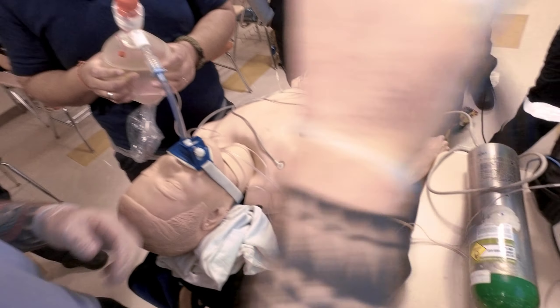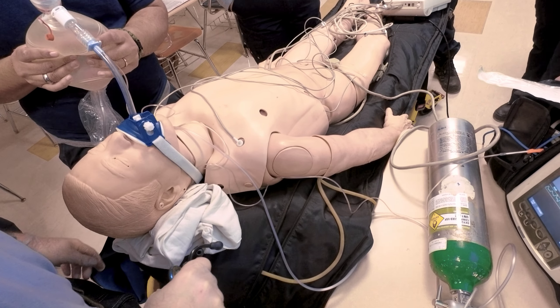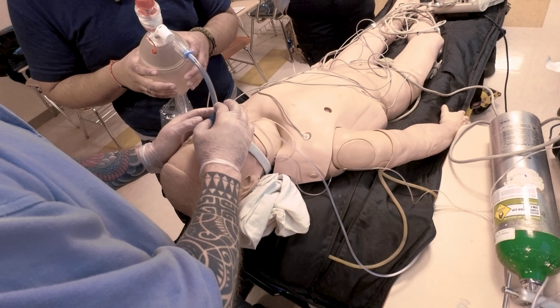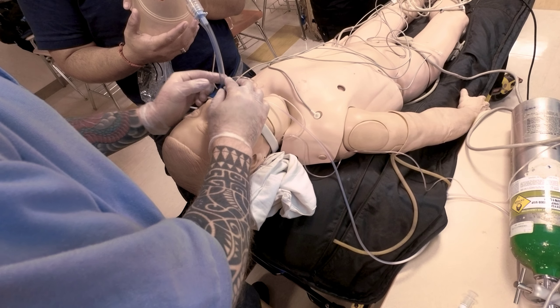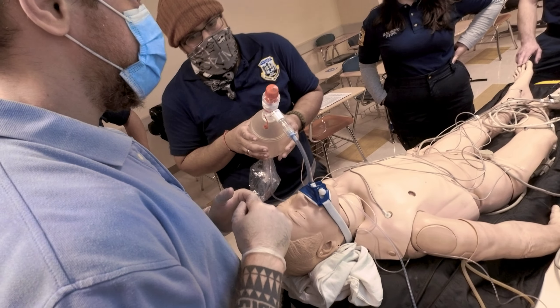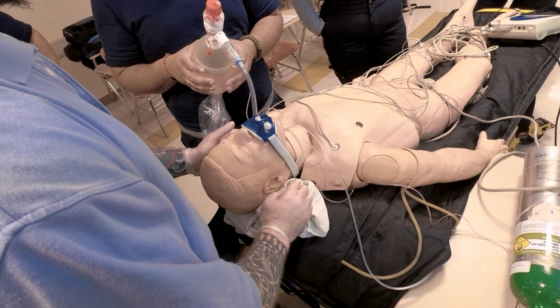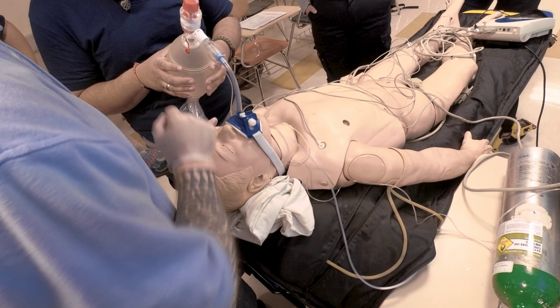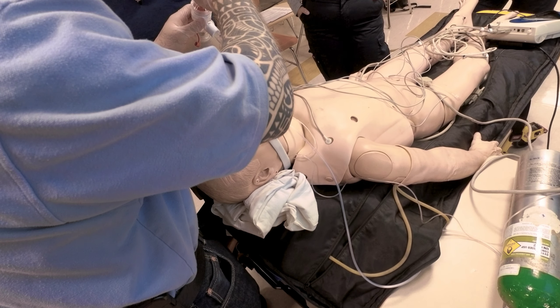Then I will secure. This is the bite block — I put it in the mouth so if the patient were to chomp down, it's not going to occlude the tube. Then connect the Velcro and the last part is the bolt. Once secured, I reconfirm: negative epigastric, positive lung sounds, end-tidal CO2 waveform capnography, pulse oximeter. If the patient has any secretions coming through the endotracheal tube, we're going to do sterile suctioning. If there's any blood or vomit, sterile suctioning. I'm missing eye protection — I should have glasses on for face protection.